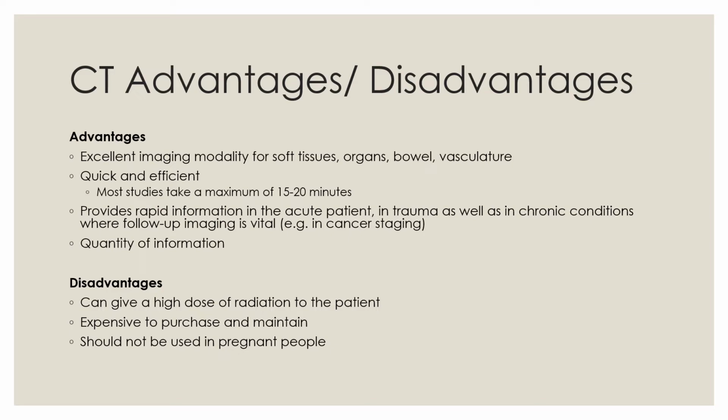Disadvantages of CT is that it can give a high dose of radiation to the patient, and so it should not be used in pregnant people and in children. I mean, it can be used, but it has to be used very sparingly and carefully. It is also expensive to purchase and maintain.